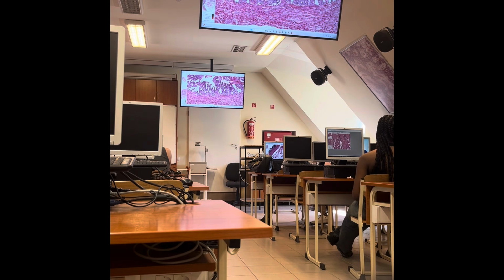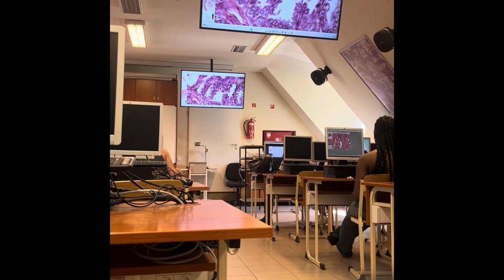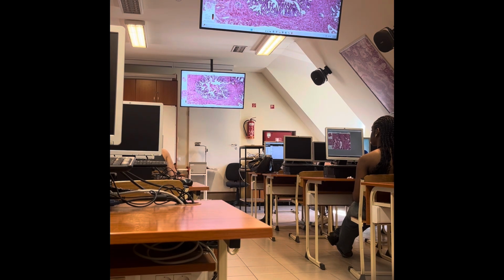Okay, in a similar image, you can see here the mucosa shows folds, with a core given by the lamina propria layer, covered by pseudostratified columnar epithelium. You can see some yellowish substance here that is most probably lipofuscin pigment, which can accumulate in some of the cells. Lipofuscin, you already heard of this.